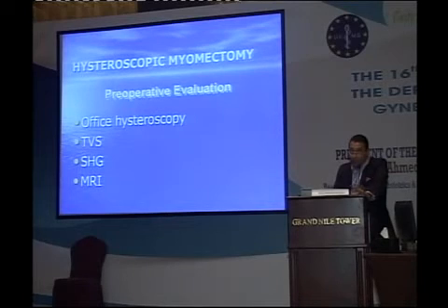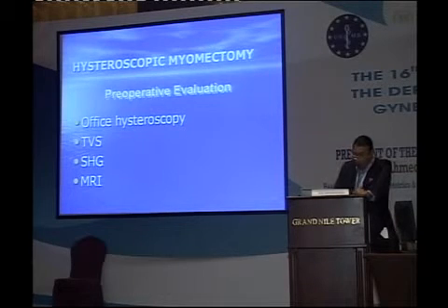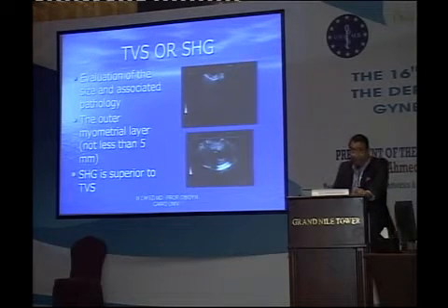There are some preoperative evaluations. I'm going through this because I need to go through it with you, as this is the basis of this session about the hysteroscopic surgical technique. You always need to perform office hysteroscopy. Transvaginal ultrasound is very important. Transvaginal sonography, and also sonohysterography, and MRI sometimes in some of the cases. Transvaginal sonography is our routine practice, of course.